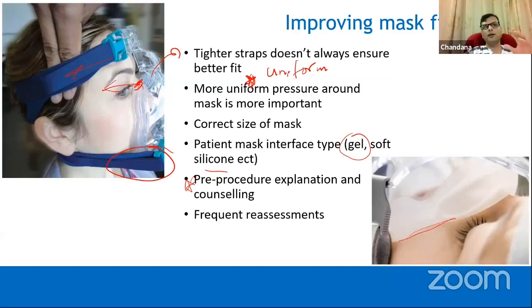But if you comply with this mask, which delivers slightly higher pressure gases, then you can avoid getting intubated, and you can take the mask out, eat and drink, and put the mask back on. So it's more comfortable. You can communicate with your relatives. They generally tend to respond much better, because they know that if they do not comply, they will have a dire consequence.